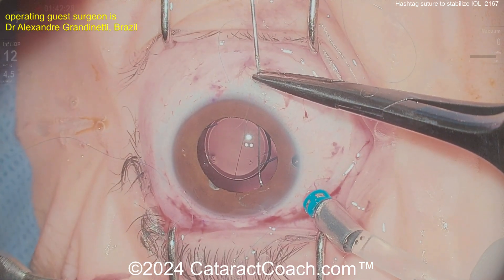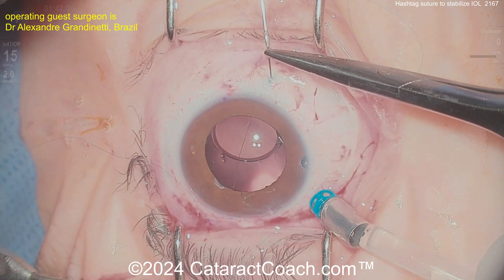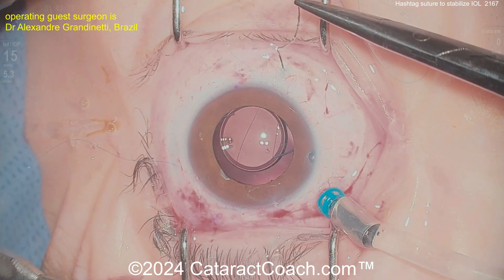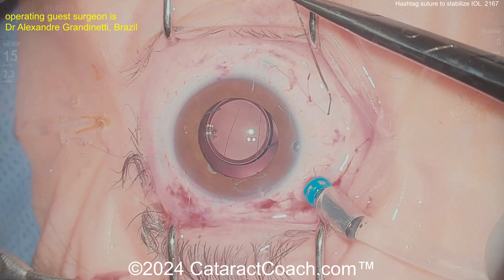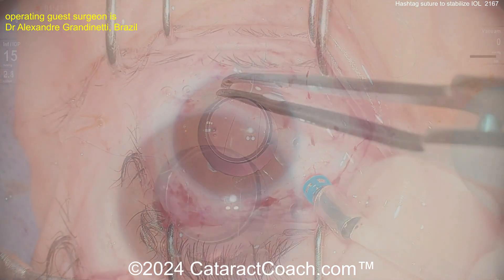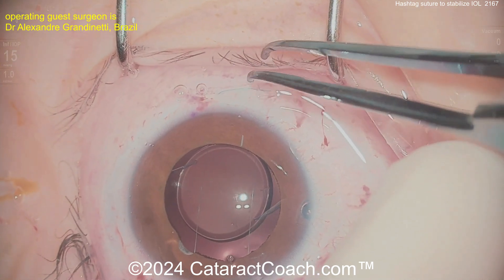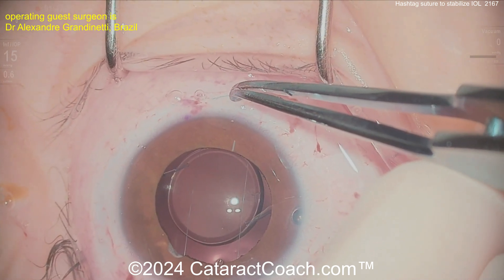But in this case, this suture is being placed anterior to the optic. You can see it starting in the sclera and then going just under the iris — placed anteriorly to the optic. You get two sutures: basically two loops, one going vertically and one going horizontally, and that will create essentially this hashtag, which is going to really hold the IOL optic in good position and prevent it from coming forward.